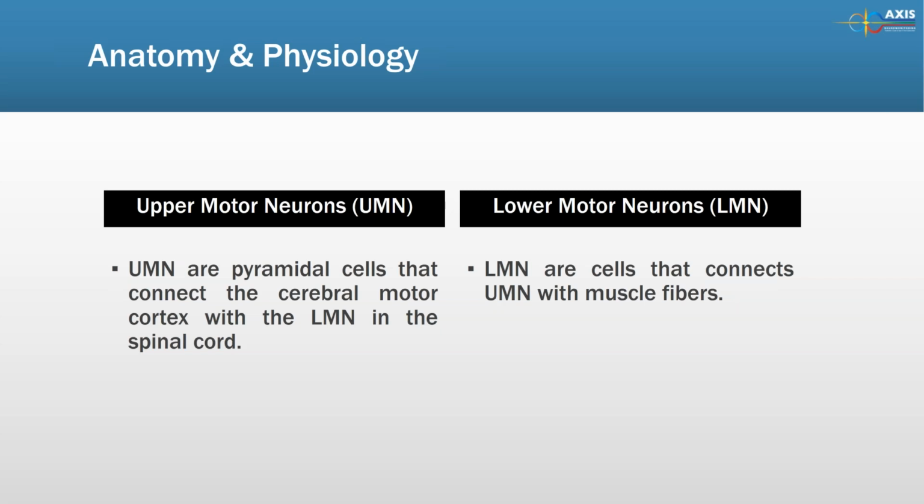When we are doing motor evoked potentials or monitoring EMG, it's important to remember that when we stimulate for MEP, or stimulate the brain or do direct cortical stimulation, we can only activate 5% of the fibers directly. 95% of the fibers in the lower motor neurons are activated through the interneurons in the spinal cord.